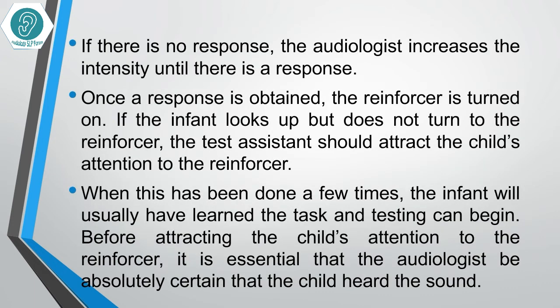If there is no response, the audiologist increases the intensity until a response is obtained. Once a response is obtained, the reinforcer is turned on. If the infant looks up but does not turn to the reinforcer, the test assistant should attract the child's attention to the reinforcer.